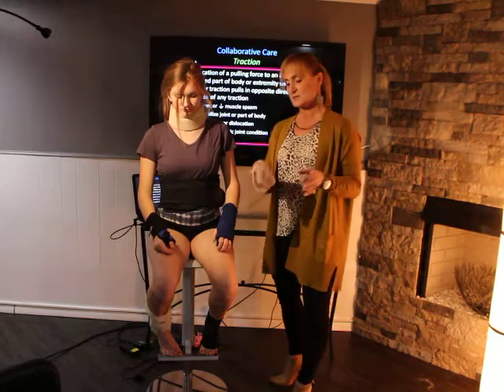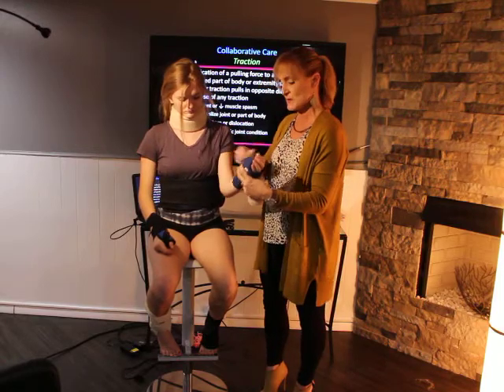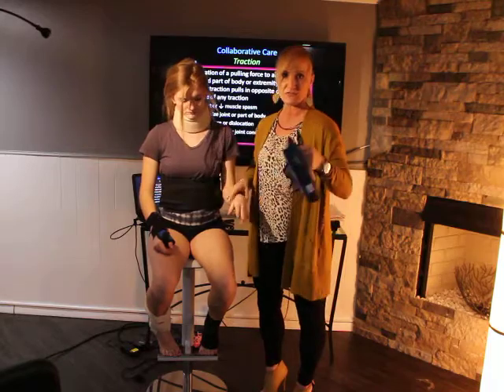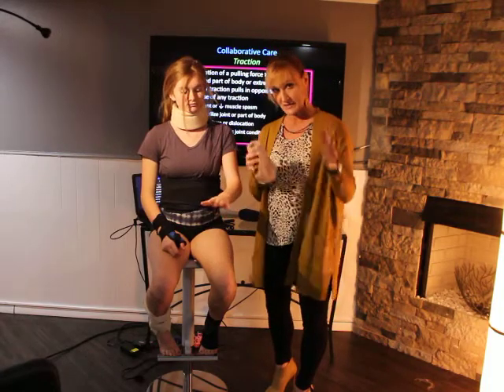Finally, the easiest one, the one that you'll probably do most often, is the ACE wrap. So I did want to show you how to put on an ACE wrap, although that's a little bit old school. But if you're working in an ER and that's your first line of treatment for your patient, you're just going to slap on an ACE wrap. So I want to show you how to do an ACE wrap.